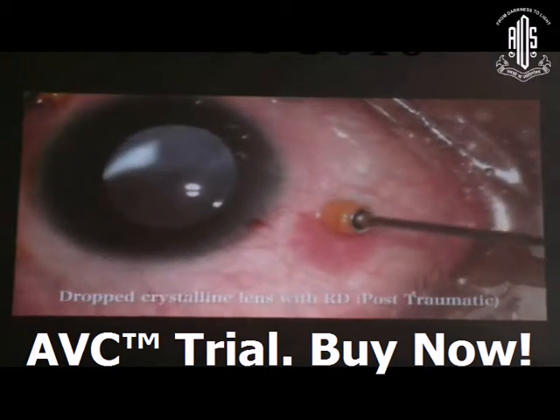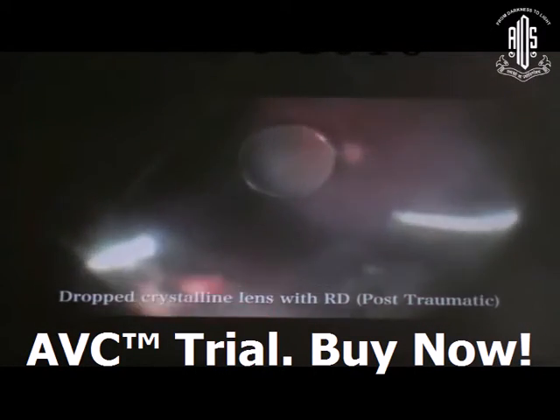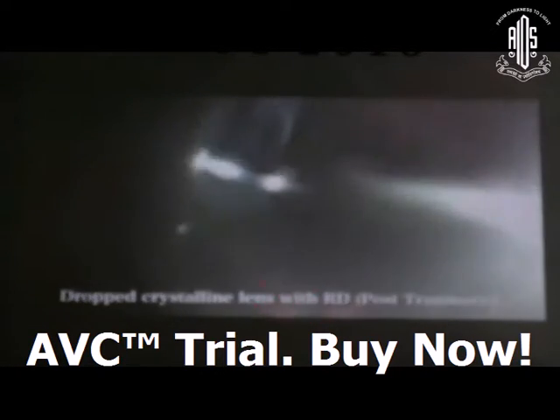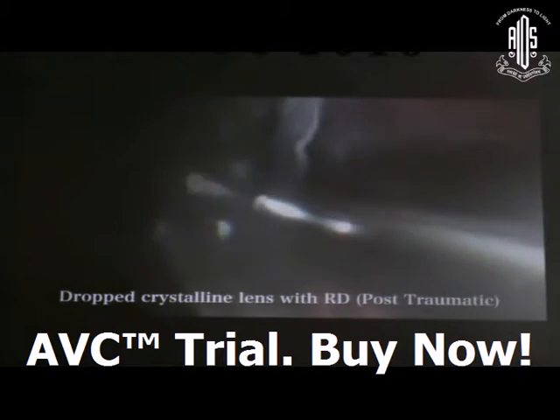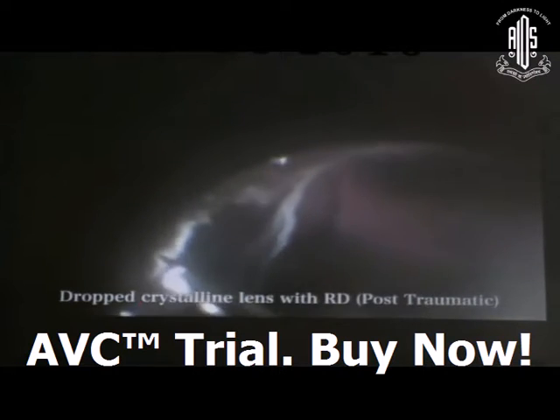In a situation with a dropped crystalline lens with retinal detachment — this was a post-traumatic case — fortunately the patient was very young, so I could manage the case with the cutter only. But sometimes you have to use phacofragmentation. There was a temporal giant retinal tear; you have to remove all the adhesions.